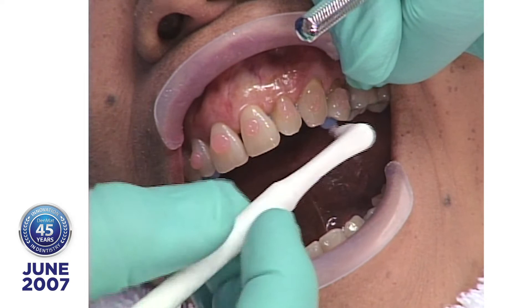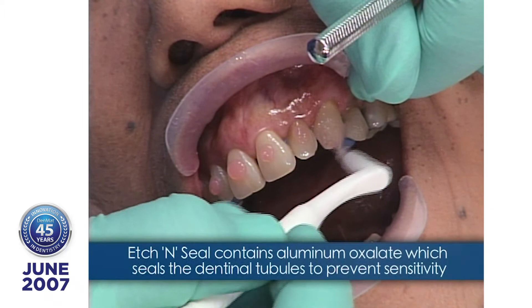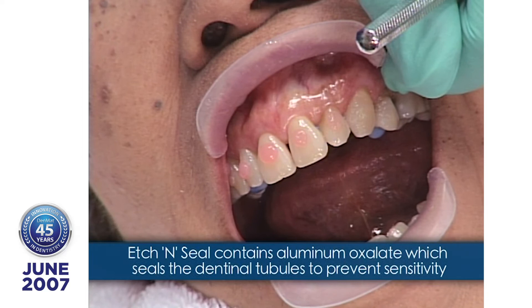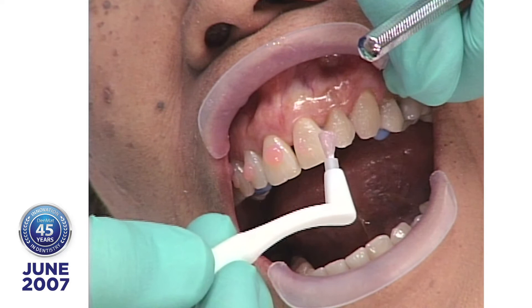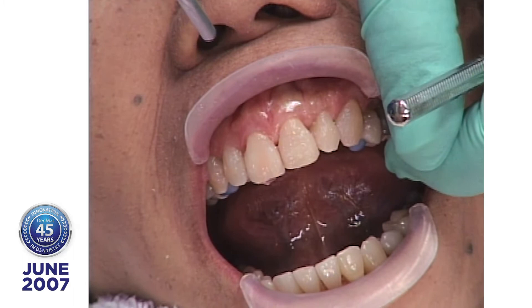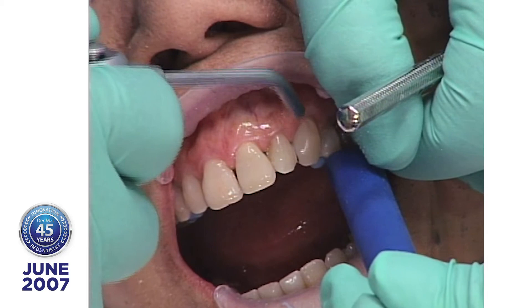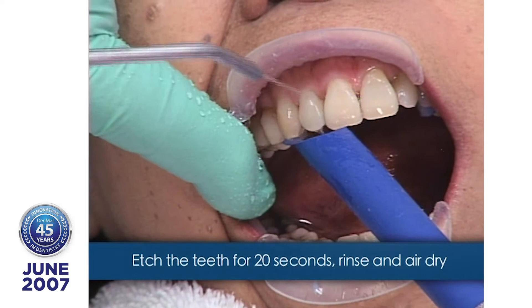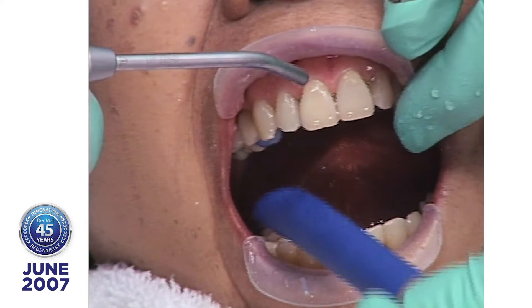The reason I use Etch-N-Seal is because it has aluminum oxalate in it. The aluminum oxalate, when you're using Etch-N-Seal on your regular operative procedures, will seal the dentinal tubules. If you seal the tubules, you prevent sensitivity. Now if any of these teeth were porcelain, we would micro-etch them, then treat the surface with Porceloc. Porceloc is hydrofluoric acid, but it has a pH of only 2.9 — compared to dental laboratory hydrofluoric acid at pH 0.9. With Porceloc, it's buffered and reduced to a very biocompatible pH.